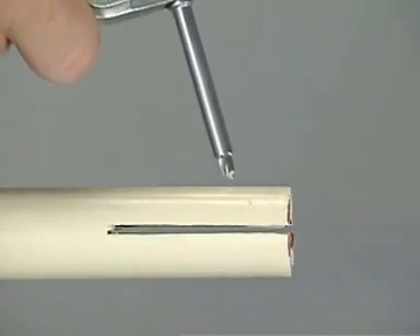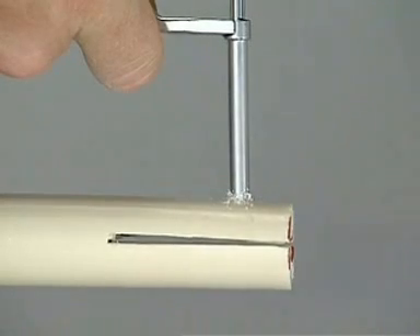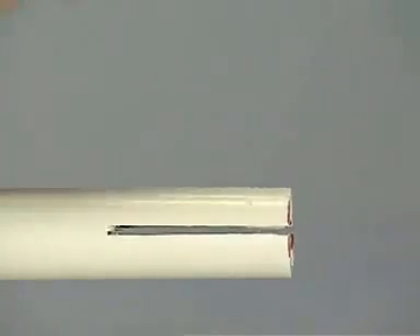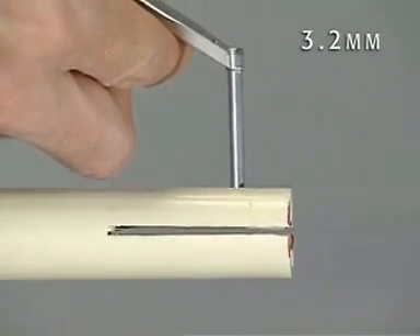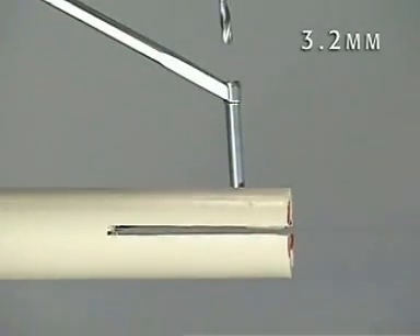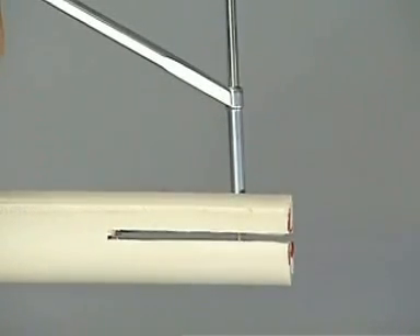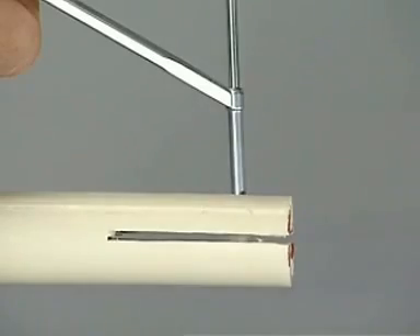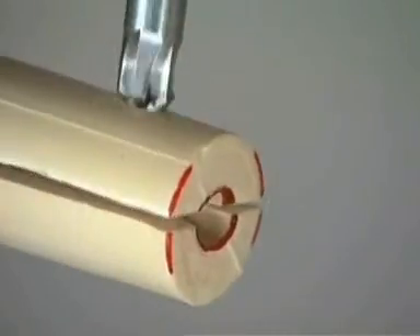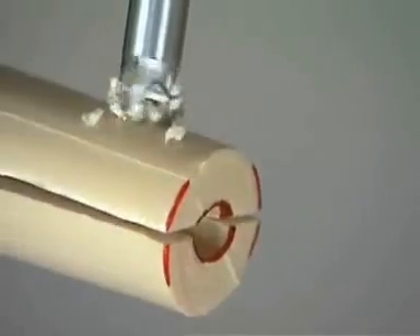At the other end of the bone model, first a gliding hole through the near cortex perpendicular to the fracture plane is drilled using the 4.5 millimeter drill bit. The 3.2 drill guide is inserted into this hole to direct the 3.2 millimeter drill bit used to drill the far cortex. This ensures that the 4.5 millimeter gliding hole and the 3.2 millimeter thread hole are aligned. Counter-sinking the hole in the near cortex reduces screw head prominence, which is advantageous in areas of minimal soft tissue coverage.